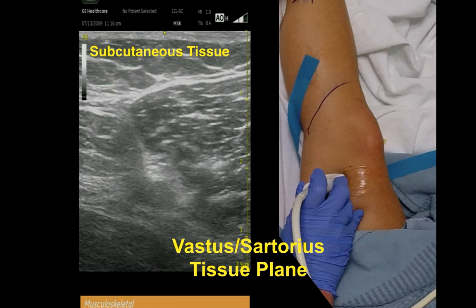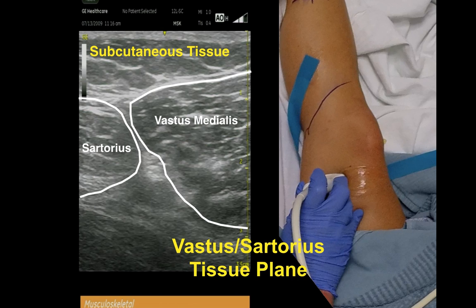In this particular example, the tendinous portion of the adductor muscles is visible and illustrated by the white arrow. As mentioned earlier, this hyperechoic structure is frequently mistaken for the saphenous nerve. Note that the saphenous nerve is not obvious in this image.